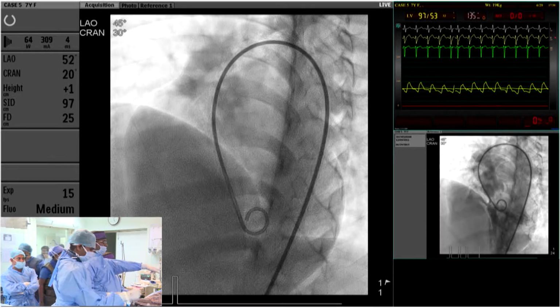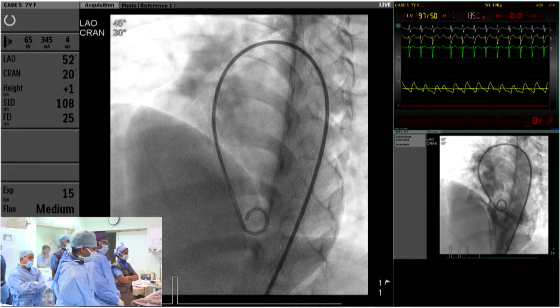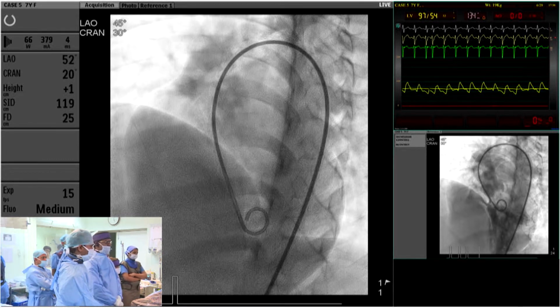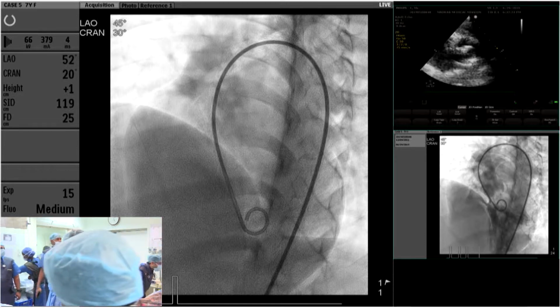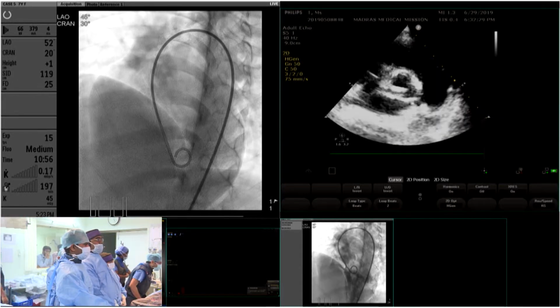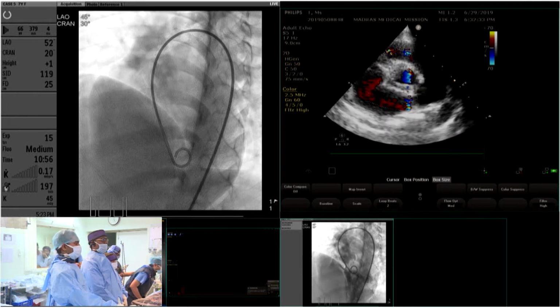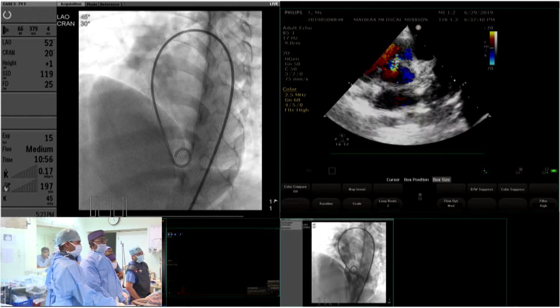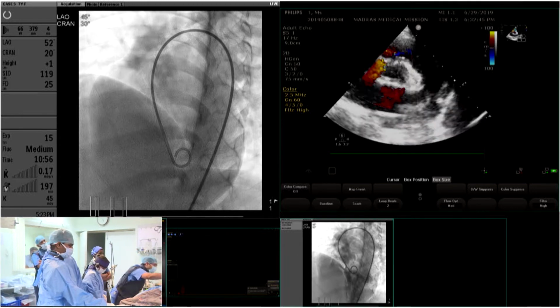We can show you a live short axis view. Get on to push the AA up. Get on quickly to your left short axis view. Dr. Santosh, my colleague, is going to show the echo. Make the echo big, echo on the screen. Put the color there, then they will color on. Get the VSD out. It's more posterior. Yeah. So that is the place where the VSD is coming off from. Get a sharper quality image. The person on the right can take over the probe.